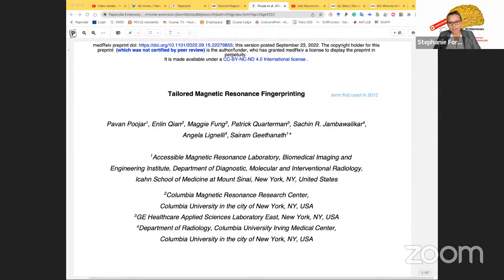So what they did here is they obviously, as I mentioned already, used machine learning, and they built a deep network where the input layer has 749 nodes. So each node is a number of the time points in the images. Then there are 4 hidden layers that all have 300 nodes each. And then the output layer, the classification, has 2 nodes, which is the T1, T2 differentiation.